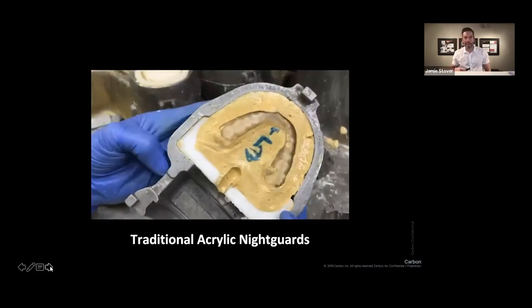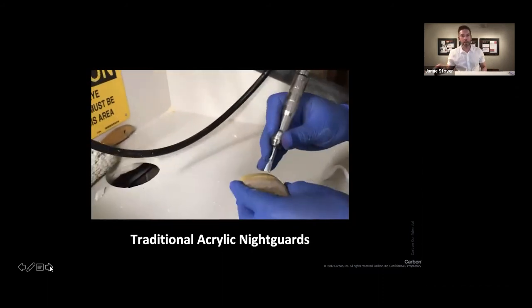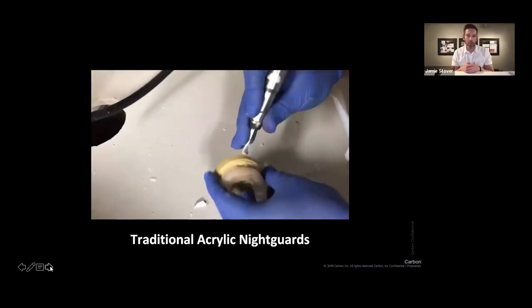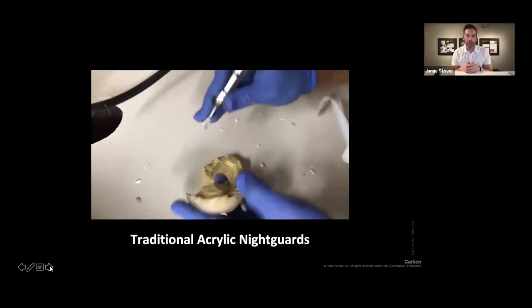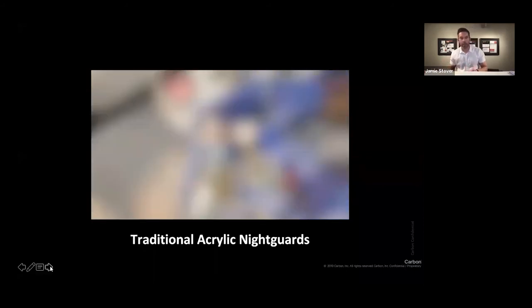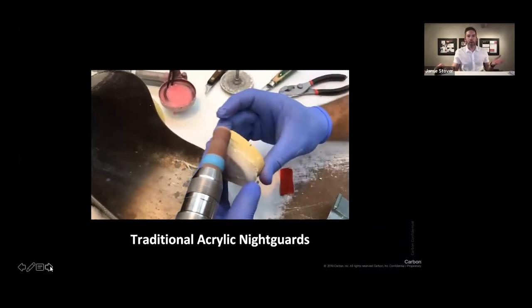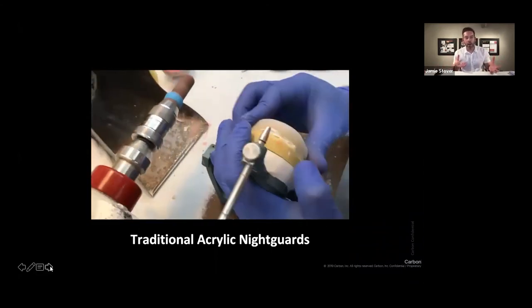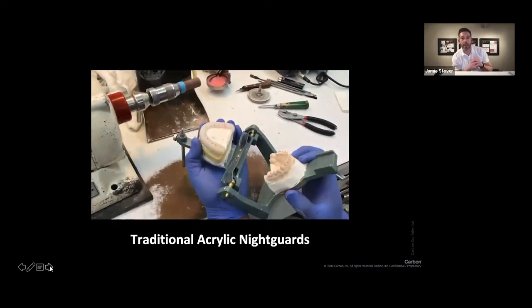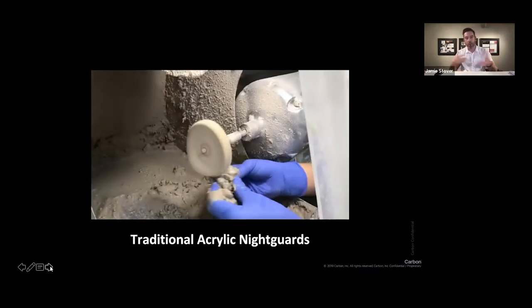Now the fun begins. Now we get out the heavy tools. Here comes a chisel. This is how night guards sometimes meet their demise, death by chisel right there in the lab, and then you start back over. You have to destroy one of the models that you created. After you chisel the stone out without breaking it, you put it back on the model that you duplicated. And then we start grinding. Why are we grinding on it? Because no matter how good a waxer you are, there are going to be variances in thickness, and we have to dial the occlusion back in, because there's expansion of the stone or of the acrylic through the process.